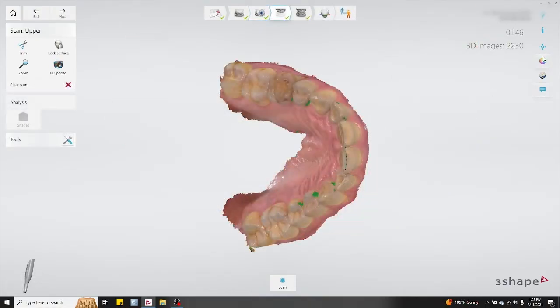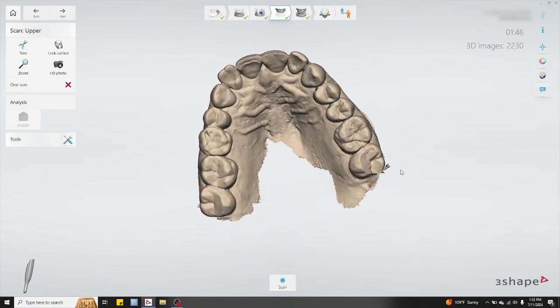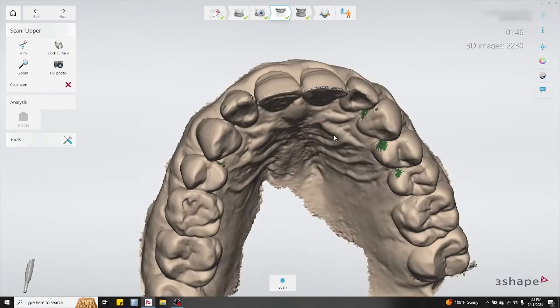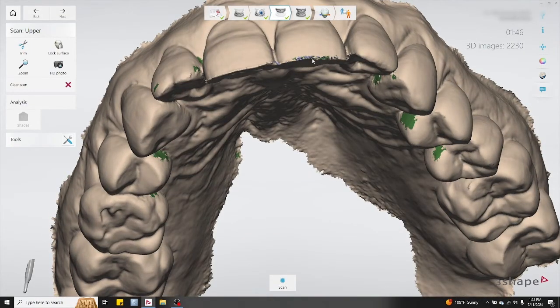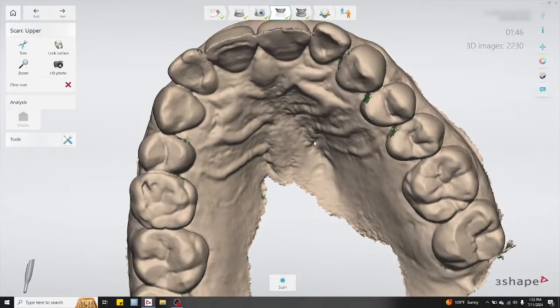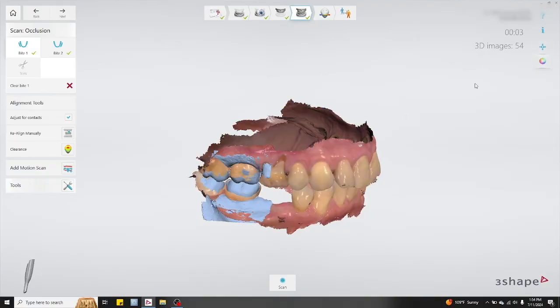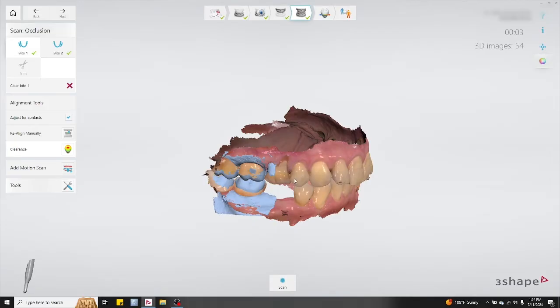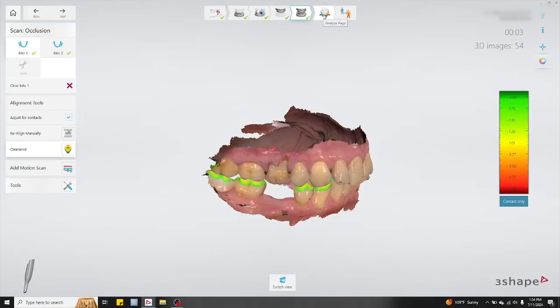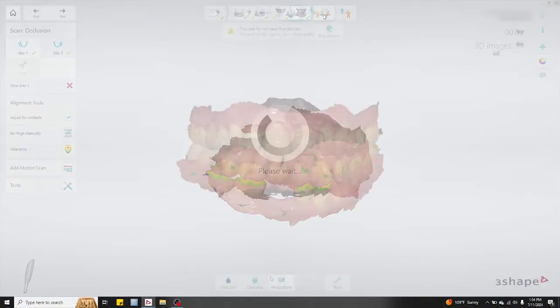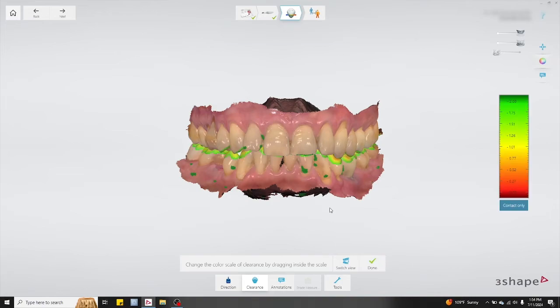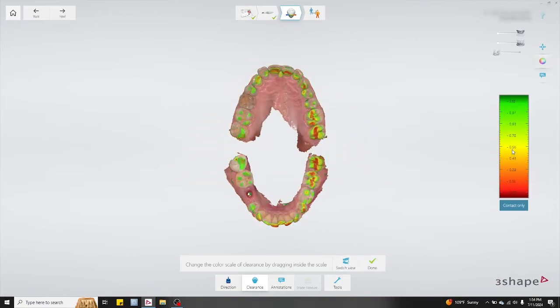The next scan is your opposing arch. It's always a good habit to turn off the color so you can detect any stitching errors or discrepancies. If everything looks good, proceed with your bite scans. Before capturing your bite scan, remember to remove the scan body and replace it with the healing abutment — that will ensure your patient is able to close down all the way. Be sure to check that the occlusion on your scan matches what's occurring in the patient's mouth. To do that, click on the clearance tab, hit switch views, and change the intensity of the contacts to see where the occlusal marks are.